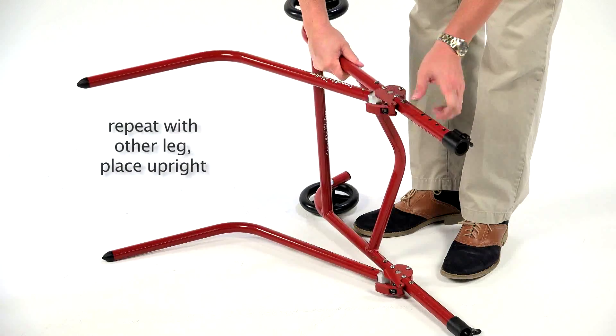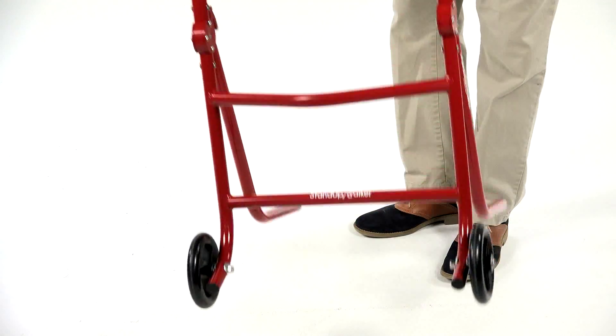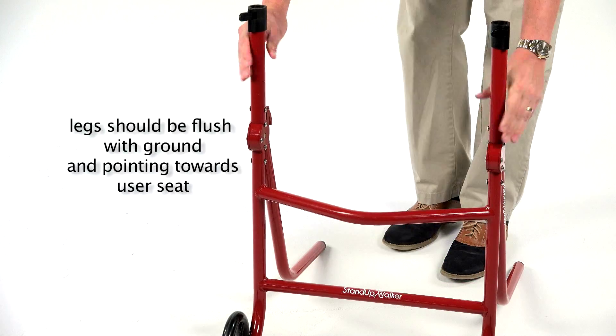Now the stand-up walker should be placed upright. The stand-up walker's ski-shaped legs should be flush with the ground and pointing towards a user's seat.